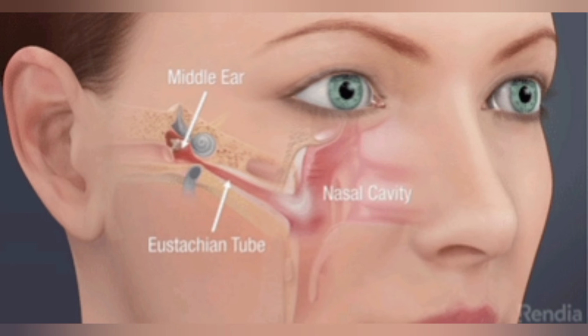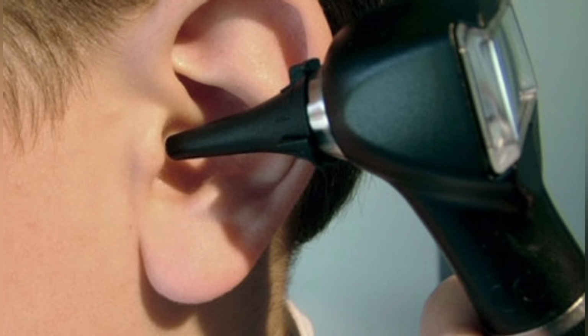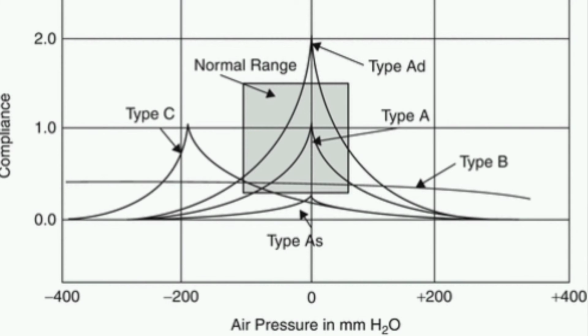The Eustachian tube patency test involves inserting a tympanometer probe in the ear canal. The output pressure in the tympanic cavity is being tested. The result of impedance audiometry is called a tympanogram. It gives values of the acoustic reflex at frequencies 500 Hz, 1 kHz, 2 kHz and 4 kHz.